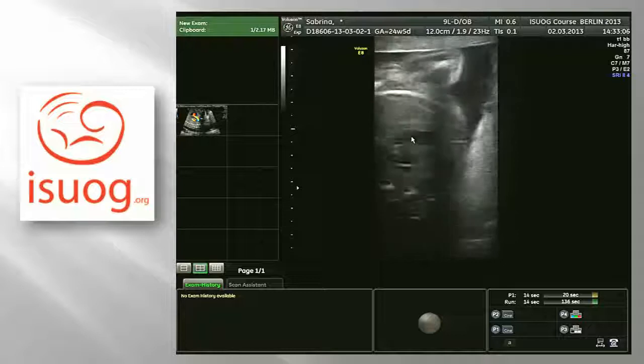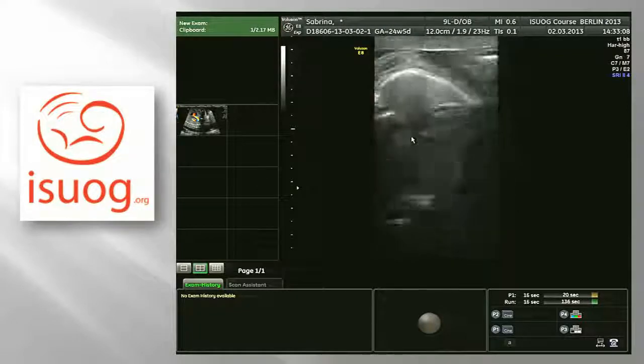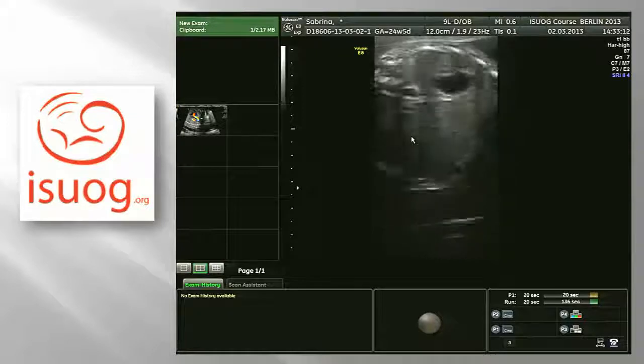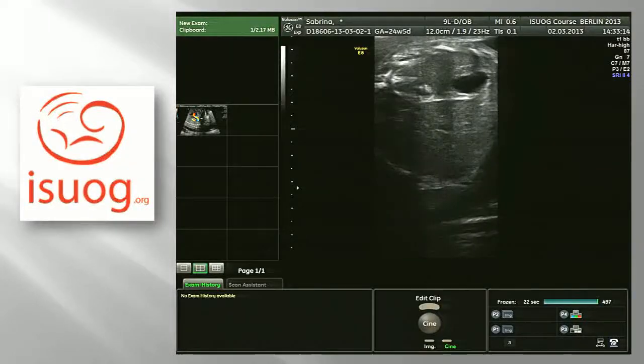So I think the baby wants to, this is typical postprandial when there is a lot of glucose, they are breathing and moving. So we thank you, Kai, and you can make some pictures for the lady, and we'll continue so that we can catch up on time. Thanks.